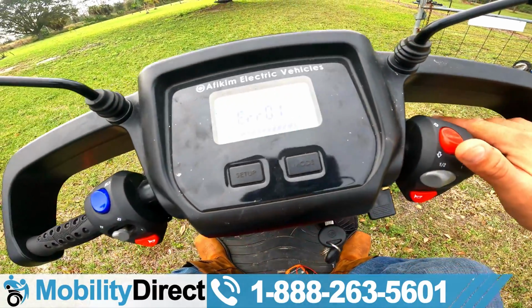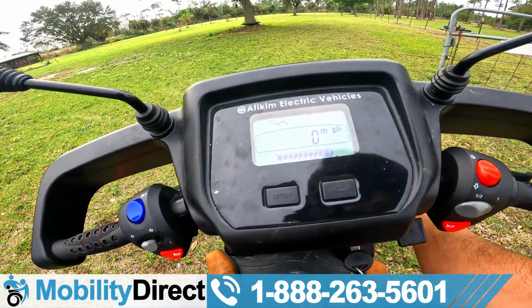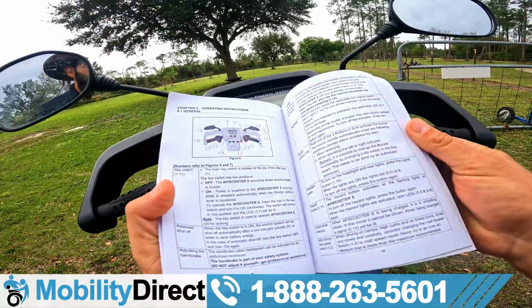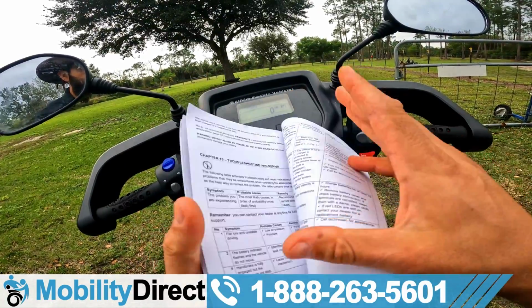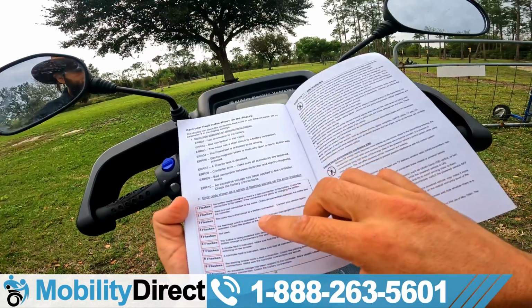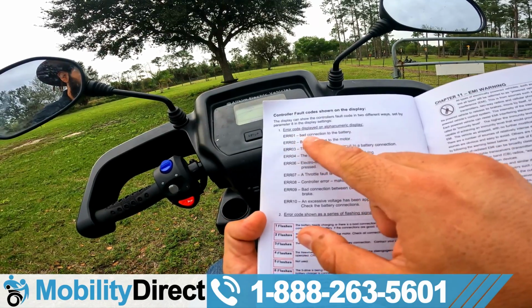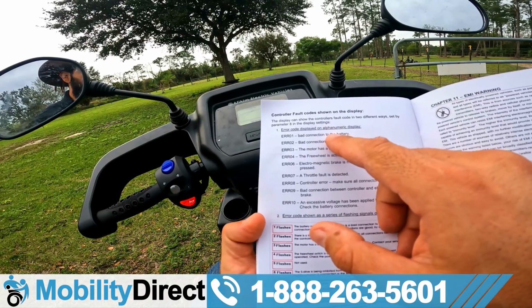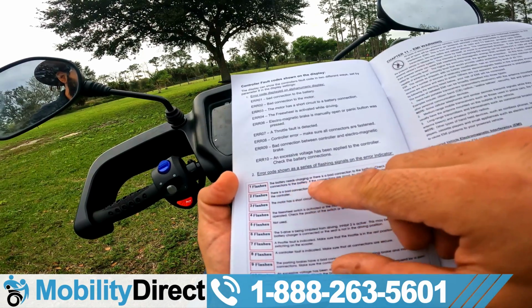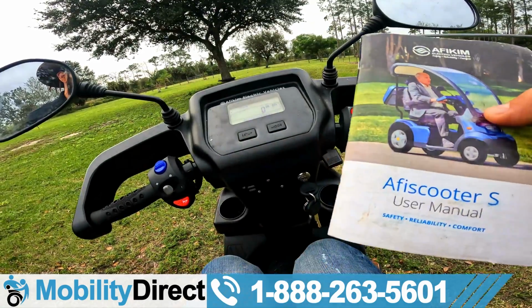It's not moving. So the first thing we really wanna do when we have a situation like this, if we look at the user manual, I already have experienced this issue before, so I know, but I'm just gonna show you. In the user manual, there's a section for troubleshooting, and it's towards the end. Now, if you go to the troubleshooting section, there's gonna be an explanation of the different error codes. Error code displayed, error 1, bad connection to the battery. So we're gonna wanna check the battery and make sure everything's okay. And it even says here, for one flash, the battery needs charging or there's a bad connection, so check the connections on the battery. If the connections are good, try charging the battery. Now I've charged the battery and it's still doing it.